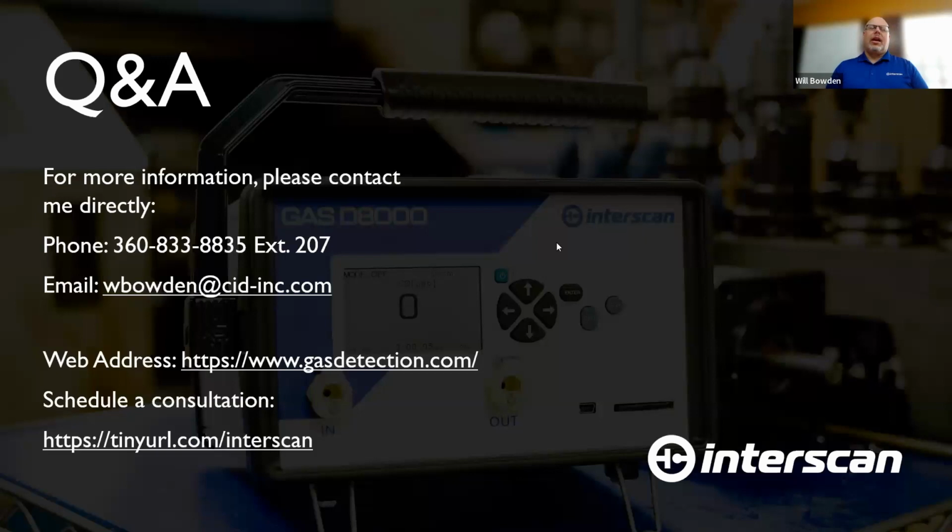No, absolutely. And that's the key in the initial application discussion that we have with each customer: we need to be aware of any other constituents, other chemicals, vapors, et cetera, that are in the environment, because depending on the measurement that we're looking at, there can be other cross interferences. And as George mentioned, these can always affect the measurement in one form or another.